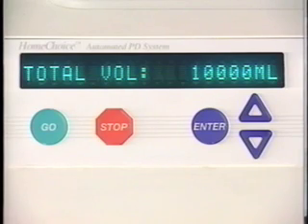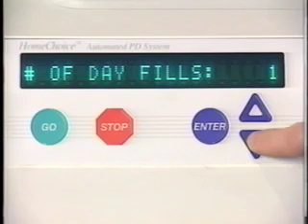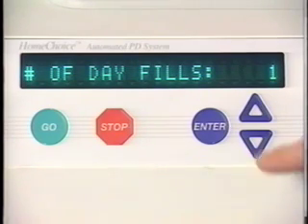The first parameter is total volume of dialysis solution to be used for the therapy. This includes day volume, night volume, and last fill volume. Press the down arrow again. The second parameter is the number of day fills. Press the down arrow again.